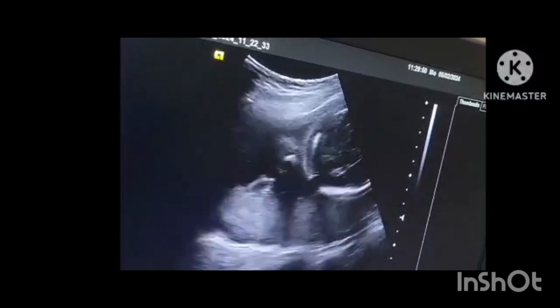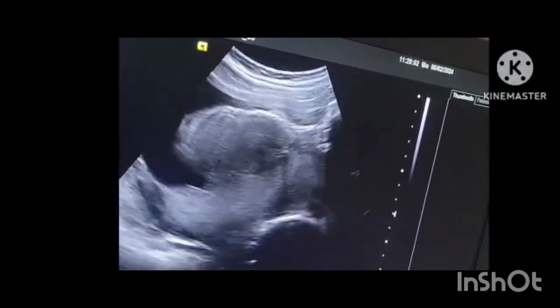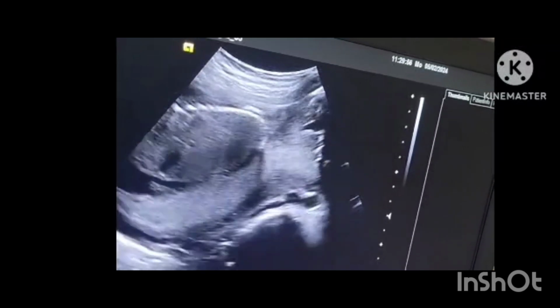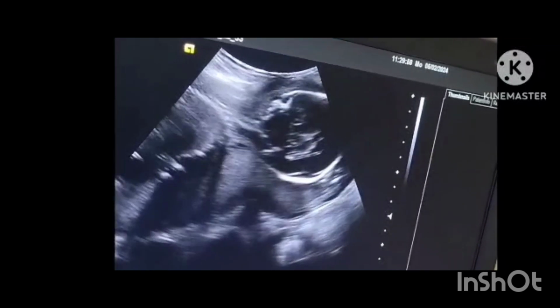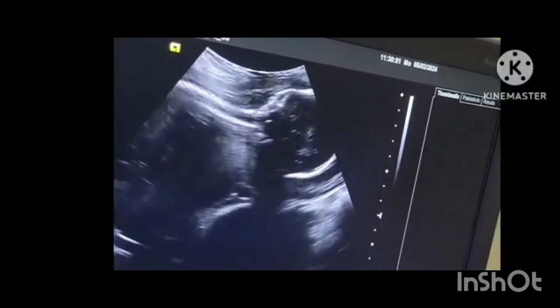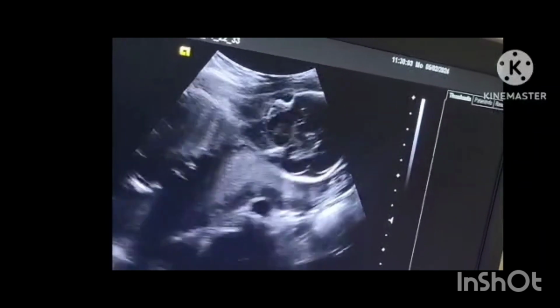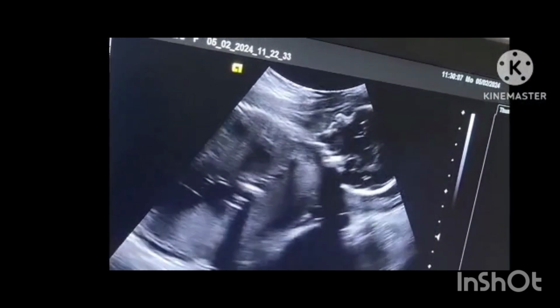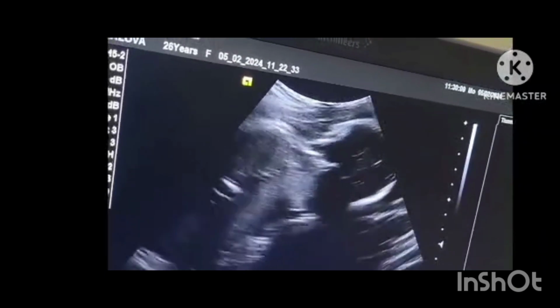Case 1. A patient presents at the ultrasound unit with a request for a scan. Patient complains of persistent right iliac fossa tenderness. The doctor requests an abdominopelvic ultrasound, suspicion of appendicitis. Lying on the ultrasound examination bed, the patient has a bulky abdomen.